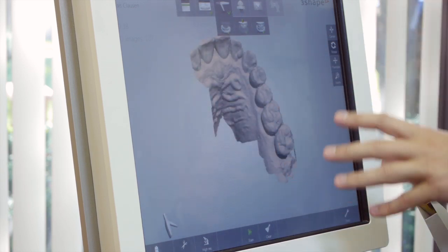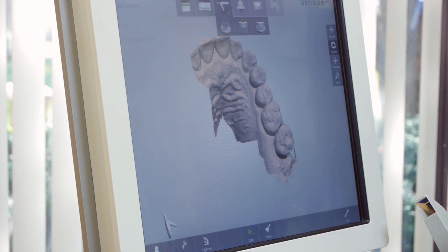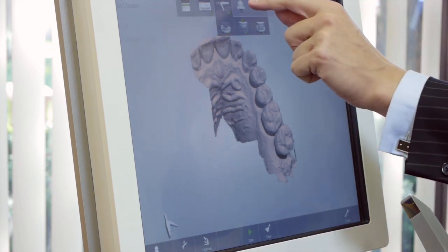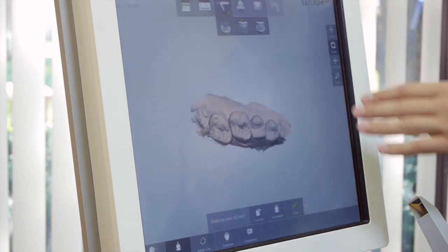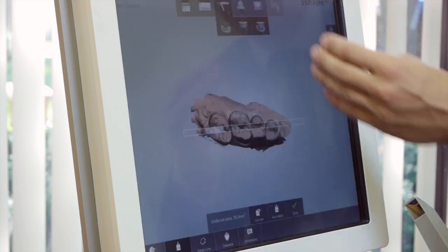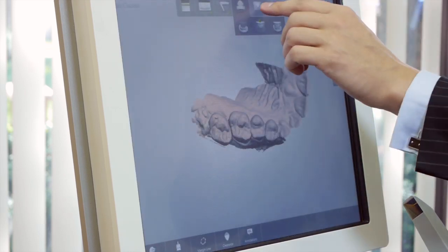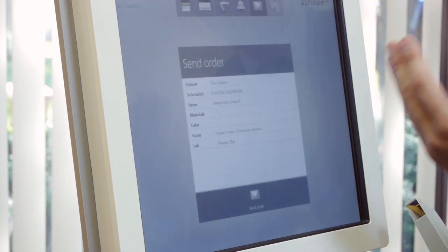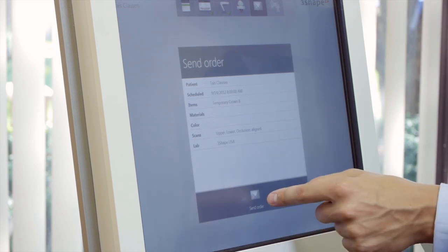So it literally scans any surface that comes in front of it, whether it's gold, silver, temp material, any material you put in front of the scanner, it will scan. And the nice thing here again is as soon as you're finished scanning, you can send directly to the lab and the lab will receive it within minutes. There's no processing or anything. So it's as simple as this.